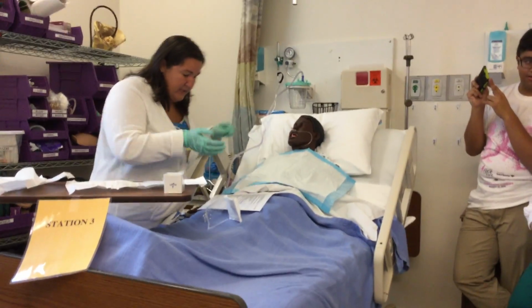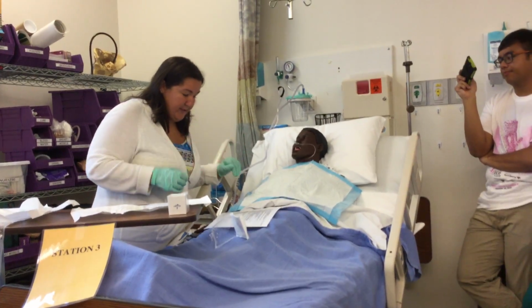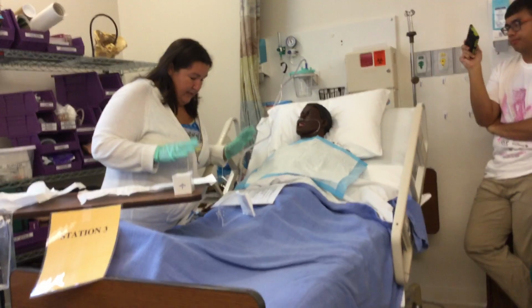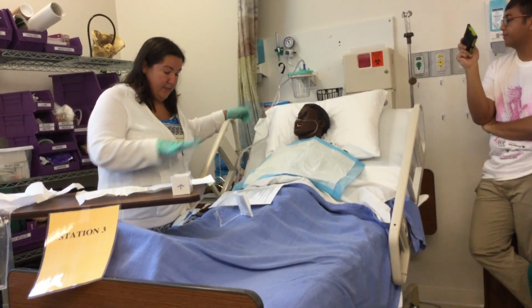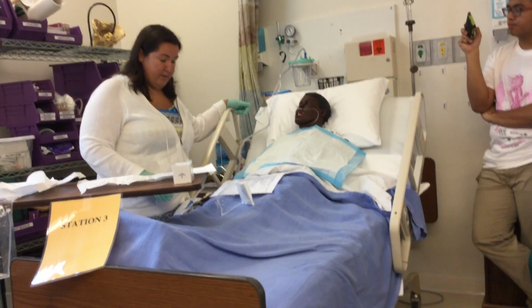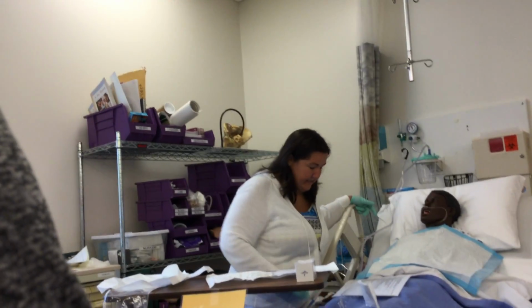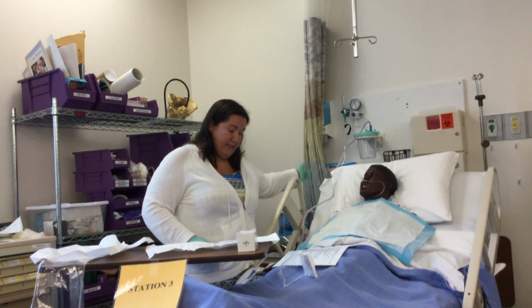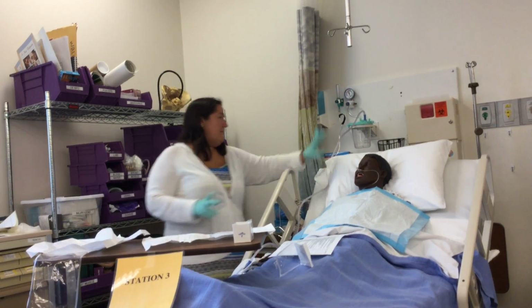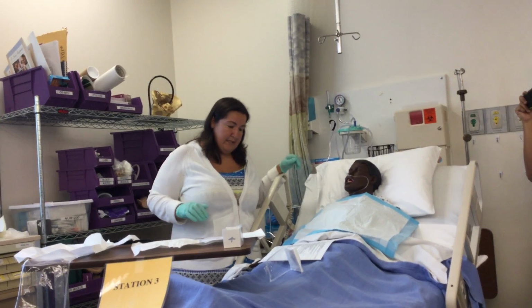So your patient is okay. Now you can take off your sterile gloves if you want, or if they're not really dirty, you can leave them on while you finish assessing them. Anything else? He's okay. Now we can put the oxygen back to where it was and listen to their lung sounds. The pulse ox should be much better now that we've suctioned them. It should be back to where it was before they weren't well. It's 90 plus, it's 95, 96. He's doing much better. So I've turned down the oxygen back to 1 liter, which is where it was. I've turned off my suction because I'm not going to need it anymore, so I can hang this up here.